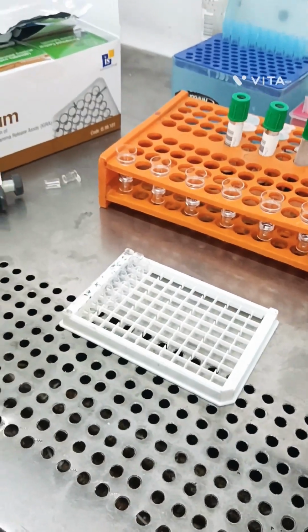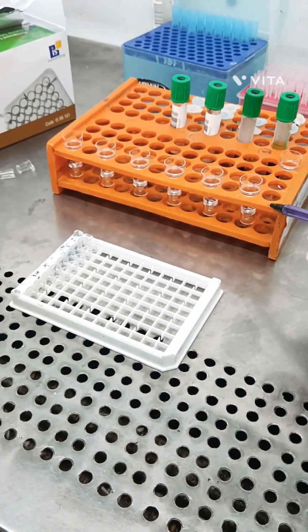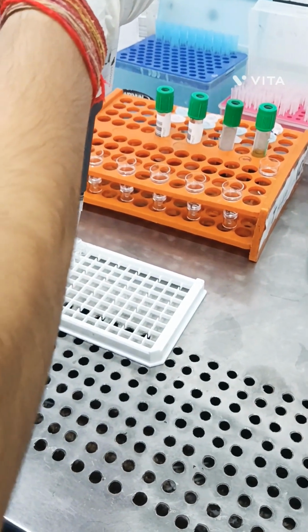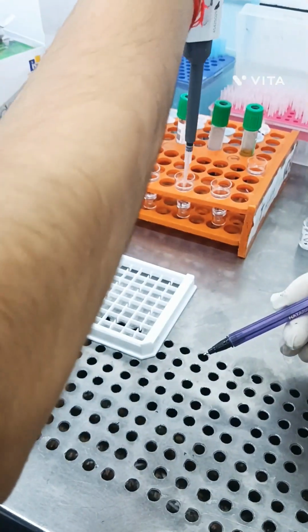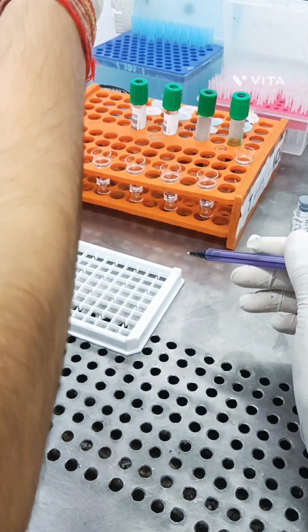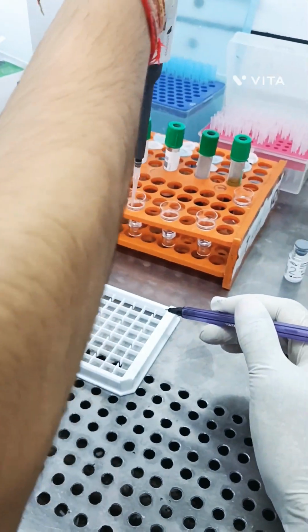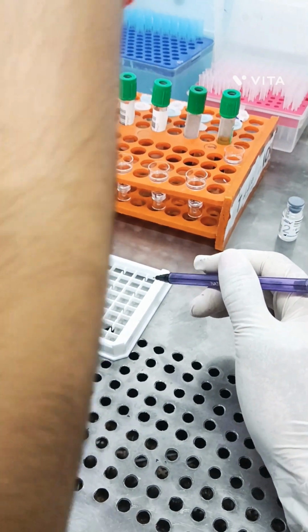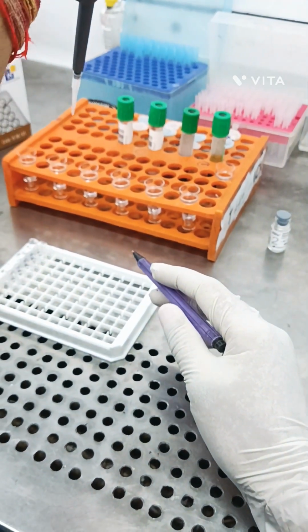In the first tube is 200 microliter, in the second to sixth add standard dilution buffer, and then serially dilute: transfer 100 microliter from 400 to the next, then 200 to 100, 100 to 50, 50 to 25, 25 to 12.5. So the final concentrations are 400, 200, 100, 50, 25 and 12.5.